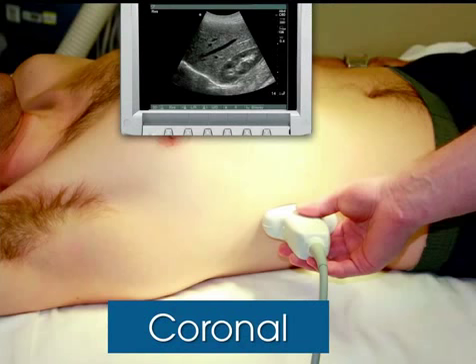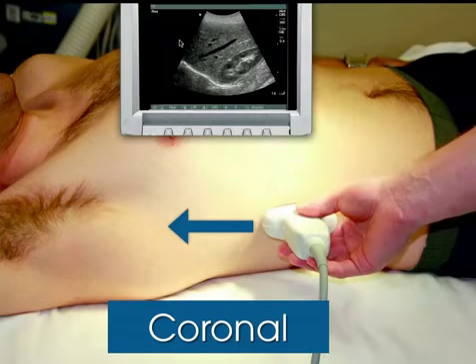Coronal is where people can get confused. Coronal also means longitudinal, like sagittal, except now we're getting a longitudinal view from the side of the body. So we've got the probe along the lateral aspect of the body, the indicator towards the patient's head, and that's why we can see the diaphragm up here superiorly, and all the way down through Morrison's pouch, we see the lower pole of the kidney inferiorly. And so this is towards the feet, this is towards the head, and this is a coronal view. It's coming from the side of the body.